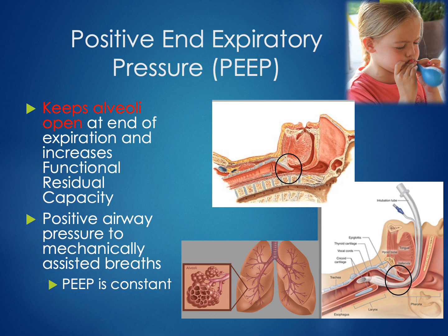Now, sometimes it's easier to think of PEEP as this constant pressure that's keeping the patient's lungs open. But when we exhale, the PEEP, or positive end expiratory pressure, is the only pressure left over in the lungs to keep them open. And that's what that PEEP setting number is, that amount of pressure left over after an exhale to keep the lungs open.